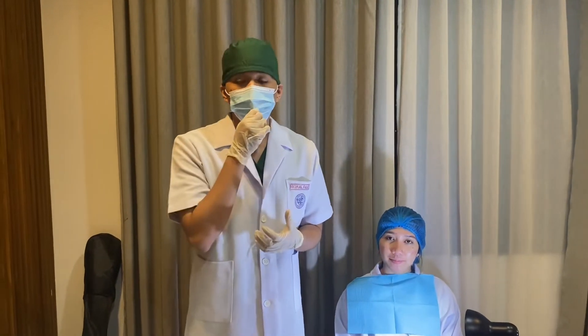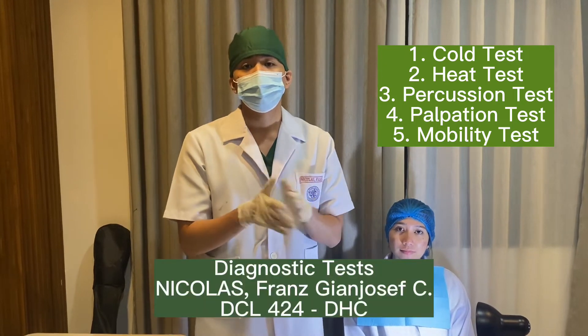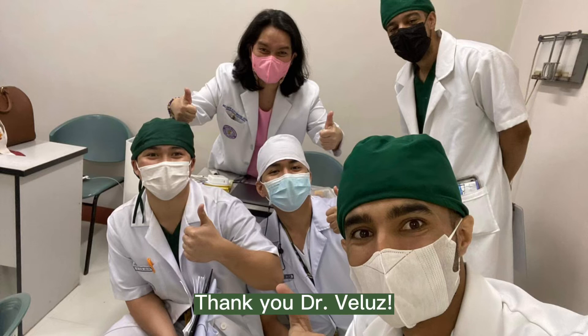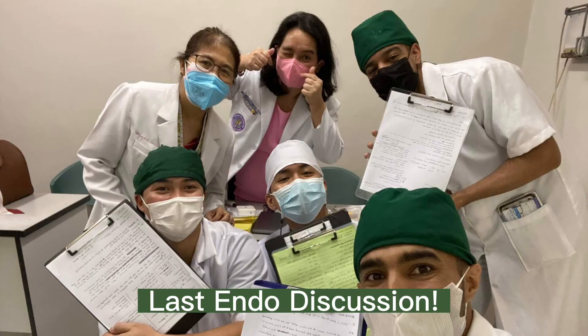That's the end of my diagnostic test. I did the cold test, heat test, percussion, palpation, and mobility test. Thank you very much and have a good day.